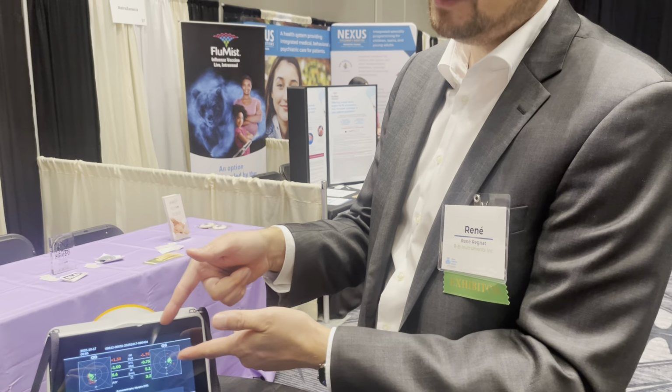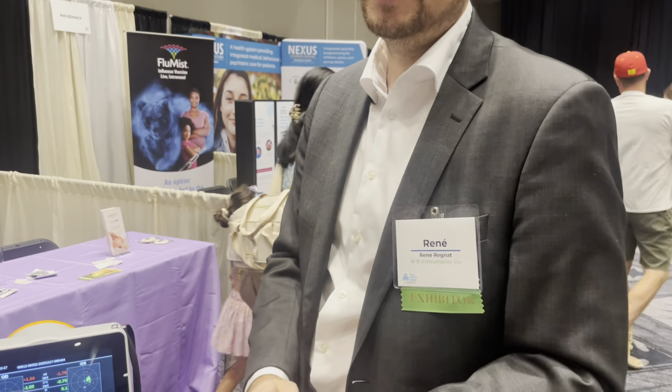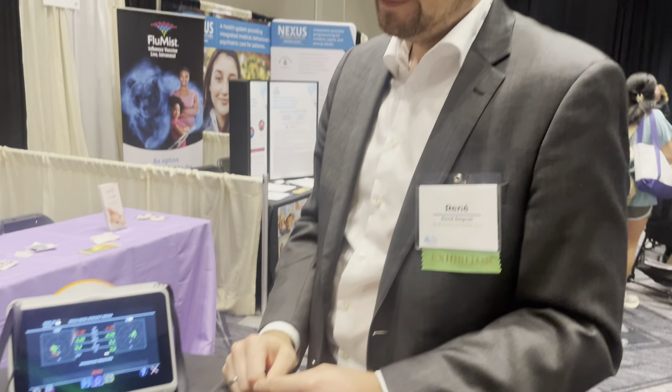It doesn't know that you have contacts in. It doesn't know if you measure over glasses or stuff. So it'll do whatever it sees in front of it. Very interesting. Very smart.